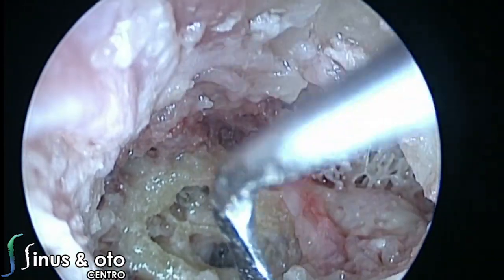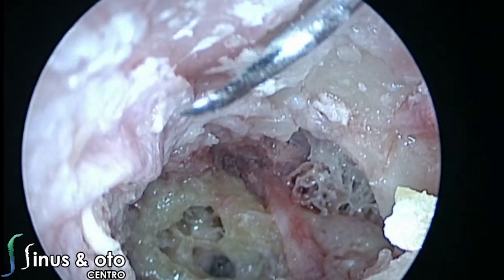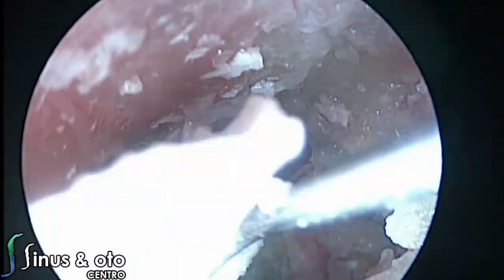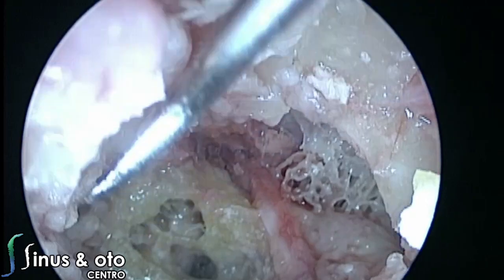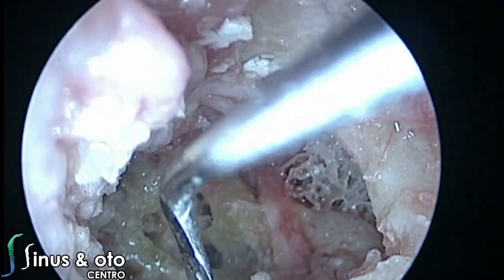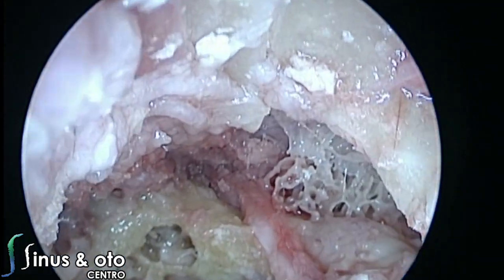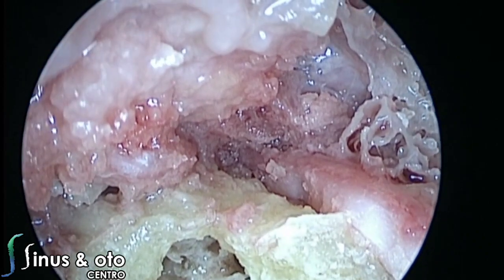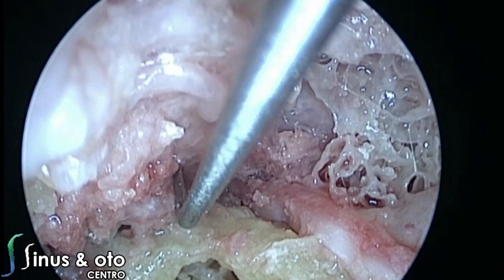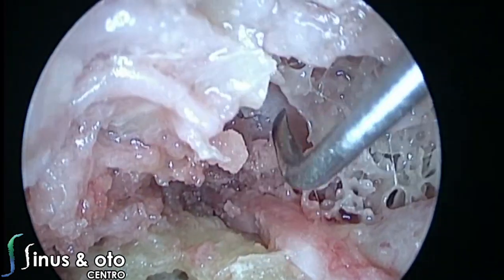So what can we show more here? This anatomy. We have already seen the inner ear with the nerves. This is the tympanomeatal flap that we can put back. Of course, the tympanomeatal flap is a little bit perforated because of the approach that we did and the drill that we used. But we can see a lot of structures. We can see the inner ear and how close it is to the external auditory canal. It always amazes me the distance between the inner ear and the external auditory canal, which is not a very long distance and not a very long approach.